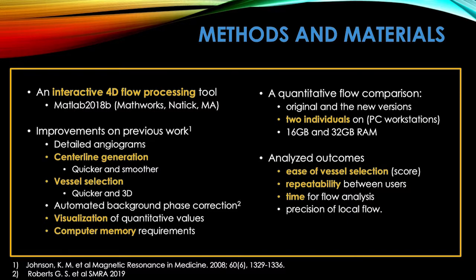The automatic background phase correction was presented earlier by Grant, and he set me up really well, so thank you, Grant, for that. Some of the visualizations you'll see later when I show a demo of the tool, and then really cutting down on the computer memory, because these data sets are huge, and I think that's a problem we have to deal with as well.